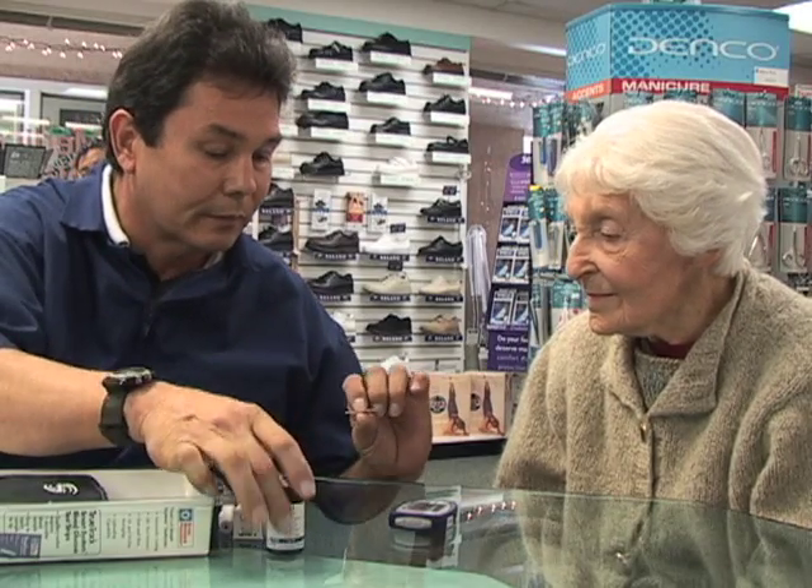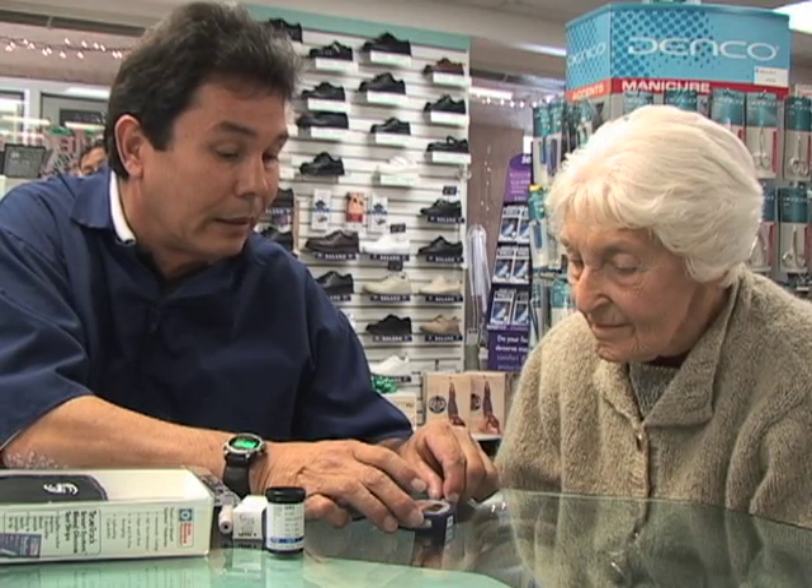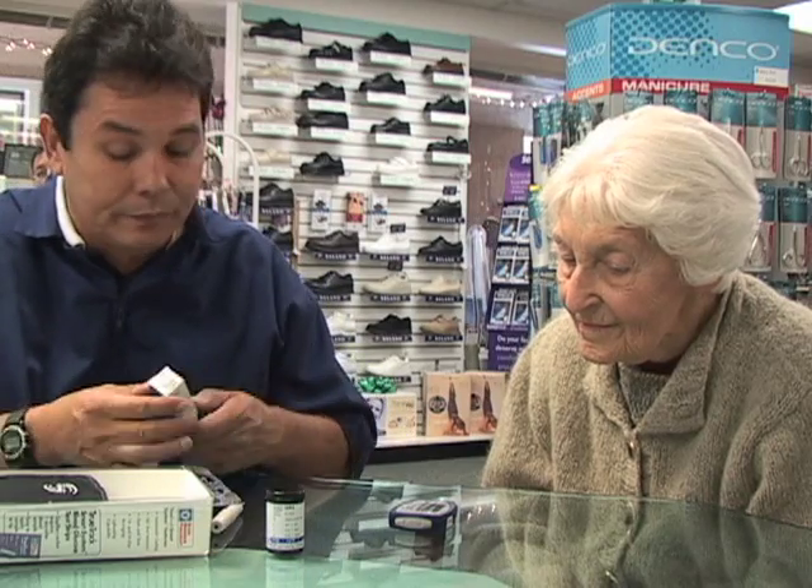Together, Joe and Mrs. Nelson perform a test. If needed, a second test or further tests are performed by the technician until the customer states that she understands and feels ready to perform the test herself.